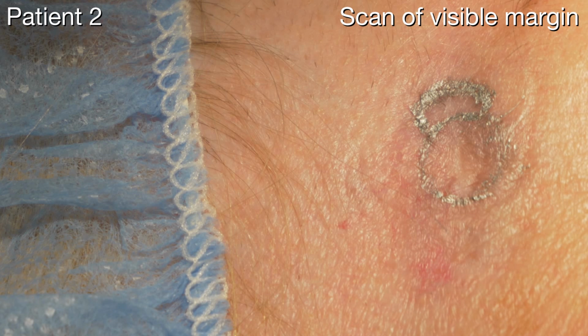And yeah, then we go on. I moved it clockwise from 12 to 3 o'clock, and then I found this tumor island. And now we'll go from 3 to 6 o'clock and see if we find something there.